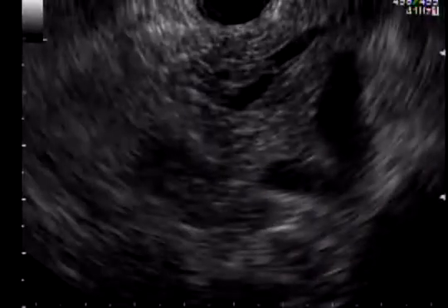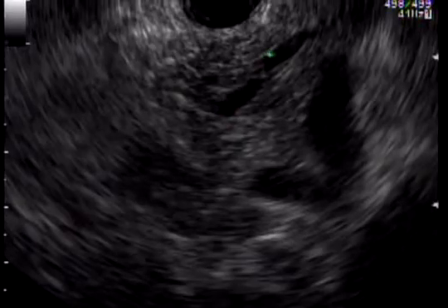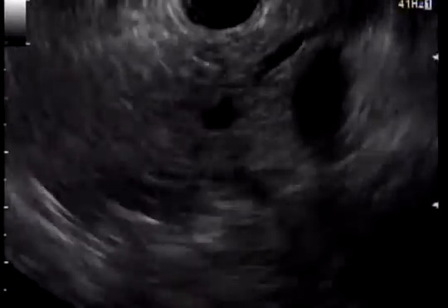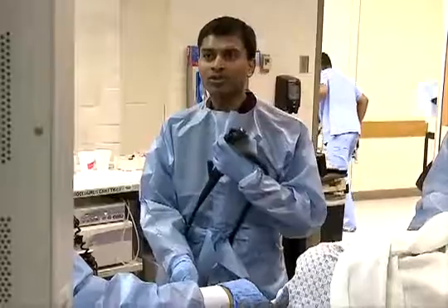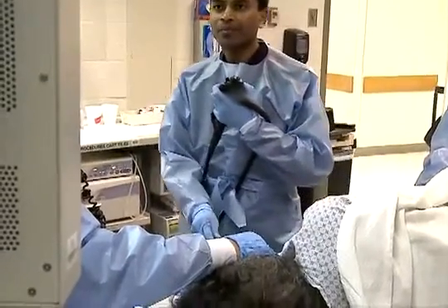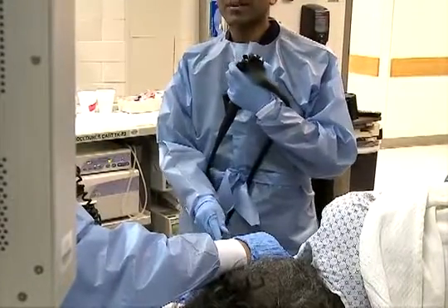There are some features of chronic pancreatitis, such as stranding and foci. The pancreatic duct is dilated. The margins of the pancreatic duct are bright, which is called hyperechoic margins. And now with the pancreatic duct in view, all that I do is to torque the scope to my right. This is a clockwise torque.